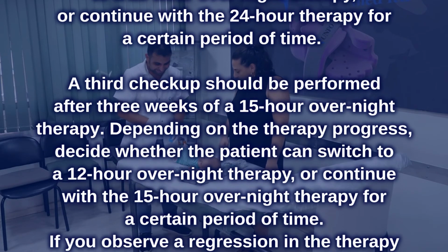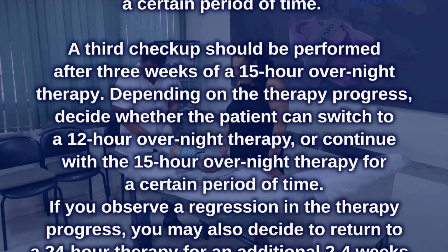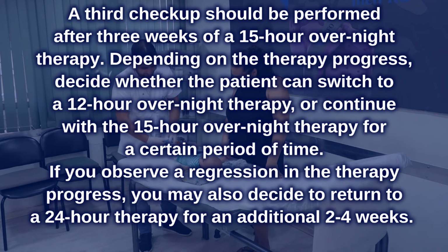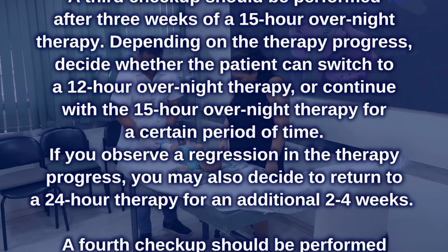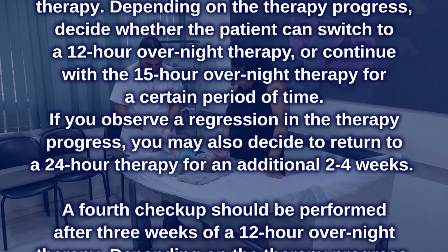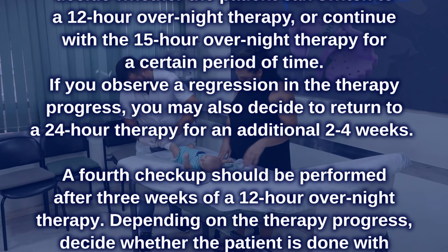Depending on the therapy progress, decide whether the patient can switch to a 12-hour overnight therapy or continue with the 15-hour overnight therapy for a certain period of time. If you observe a regression in the therapy progress, you may also decide to return to a 24-hour therapy for an additional 2 to 4 weeks.